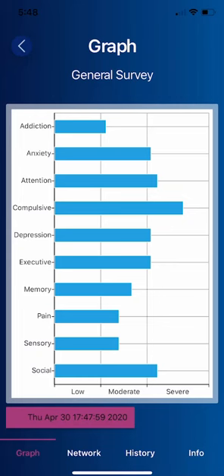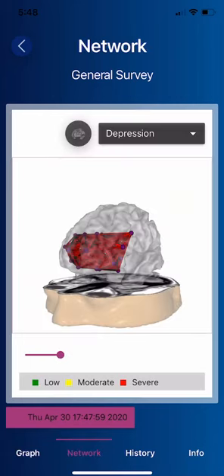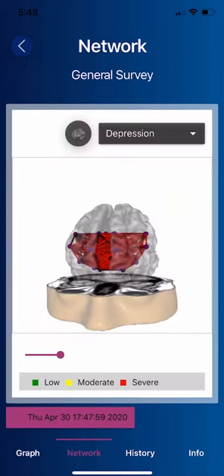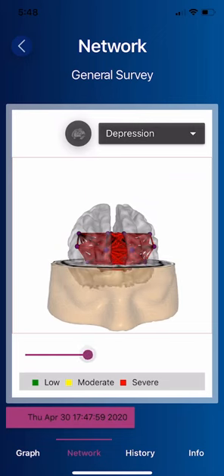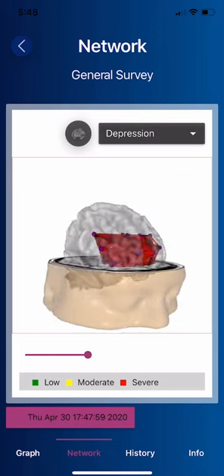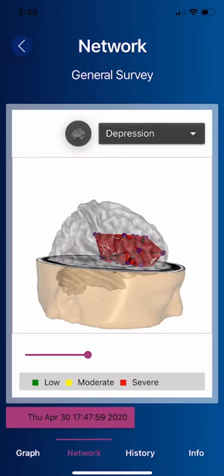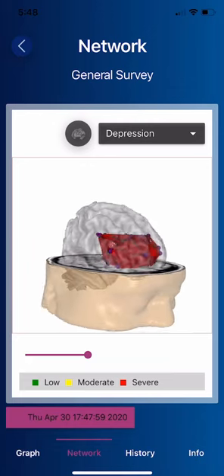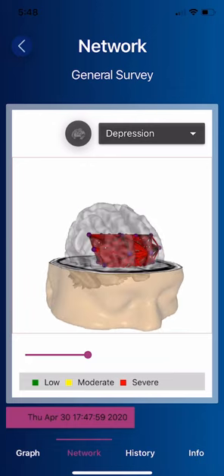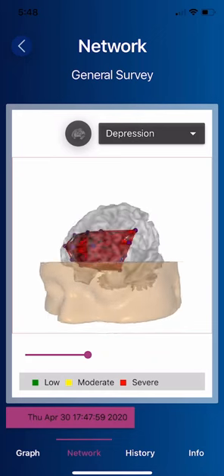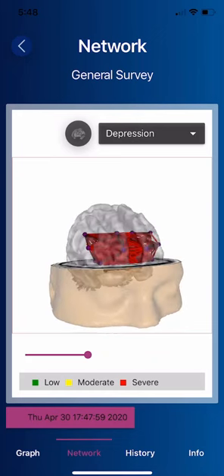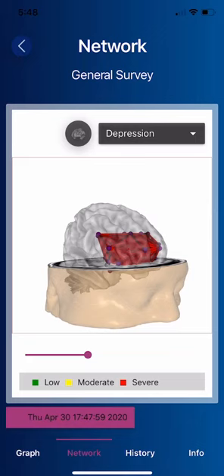For example, here's the depression network. This allows you to evaluate that network. All of these networks are based upon PET scans, functional MRI, SPECT scans, EEG, and MEG as published in the National Library of Medicine, developed over several decades at the National Institutes of Health.